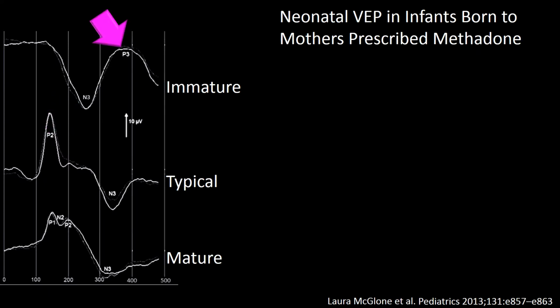And that the peak indicated by the arrow here is labeled P3 and not P1 or P2. The same goes for this peak now pointed by the arrow. As you can see, it is labeled P2 despite being the first positive peak found.